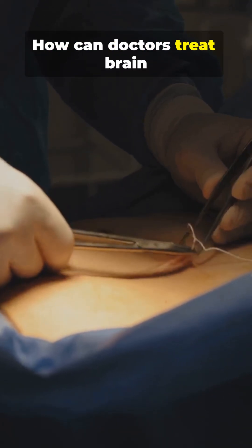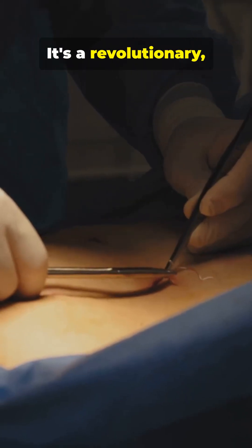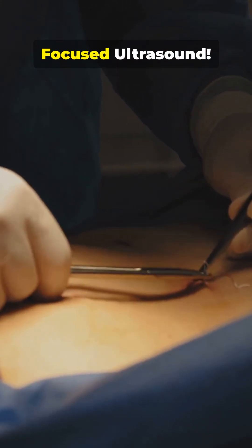Stop scrolling. How can doctors treat brain tumors or dissolve blood clots without opening the skin? It's a revolutionary non-invasive technique called focused ultrasound.